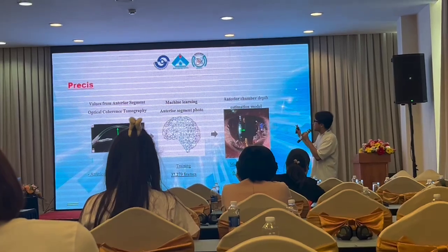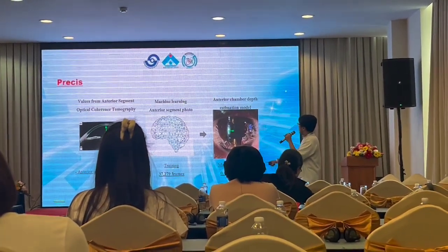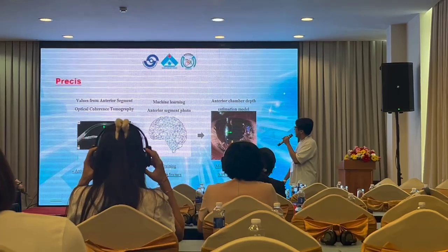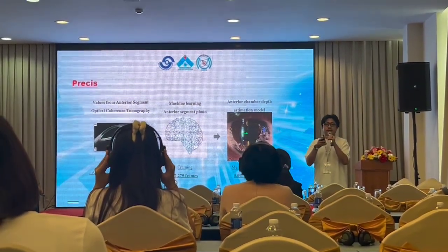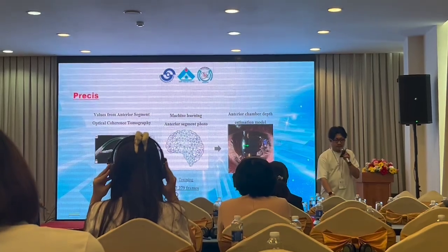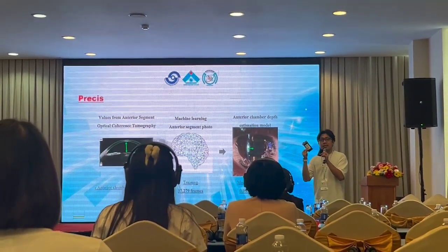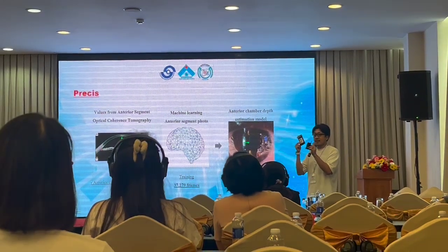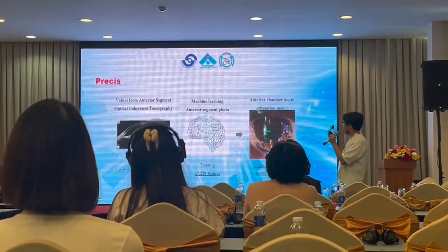This is the précis of our study, what we have achieved and what we have done. We use the anterior segment OCT to measure the patient's anterior chamber depth. We use this Smart Eye Camera, the portable slit lamp microscope, to record the patient's eye. Same patient, same time, same circumstances.